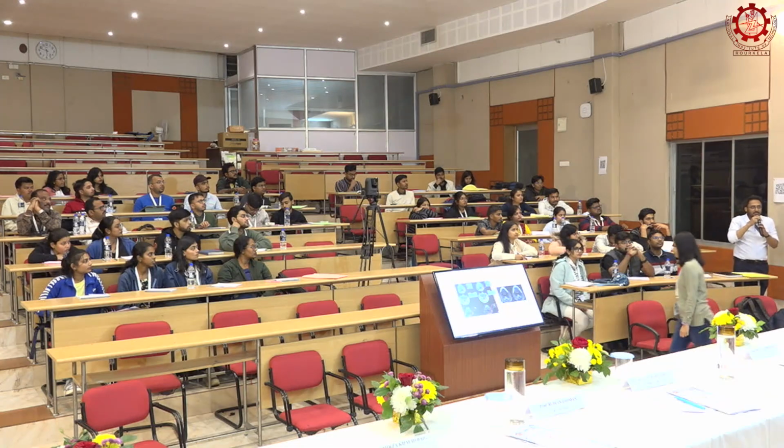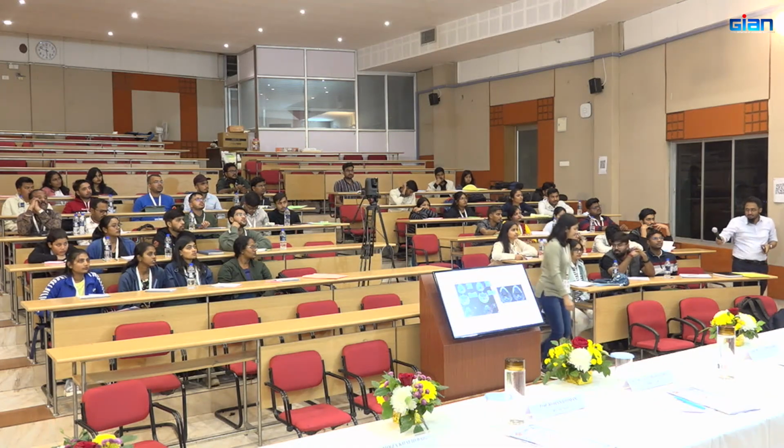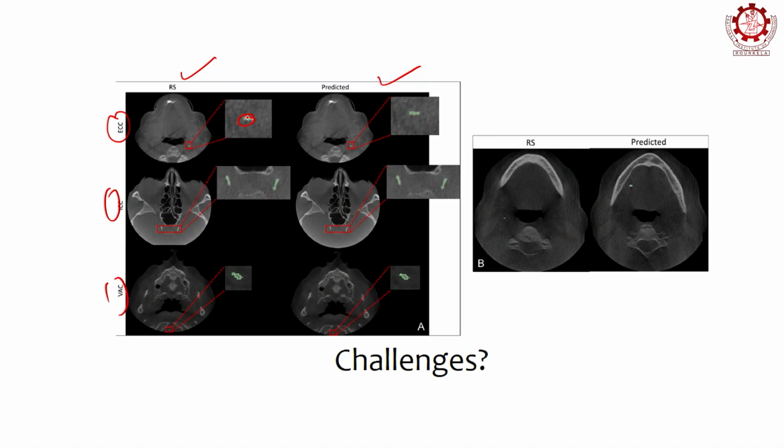Perhaps the feature size is very small, hard to detect. So you have really small calcifications here. Just look at how big the image is and how small the calcification is. It's probably less than, let's say, 0.1% of the total number of voxels in the image.